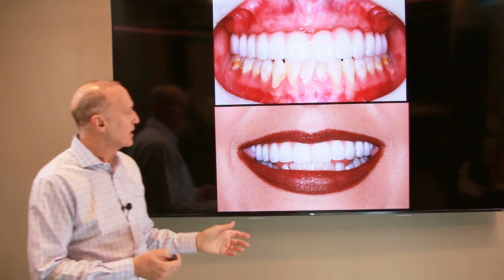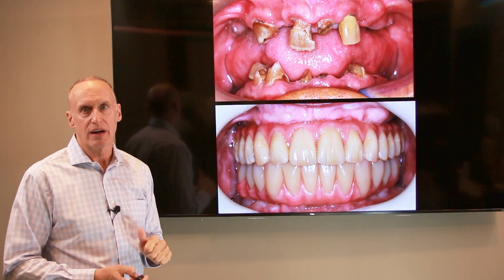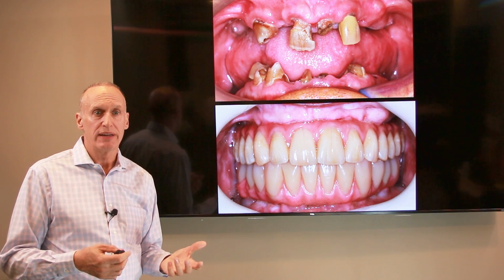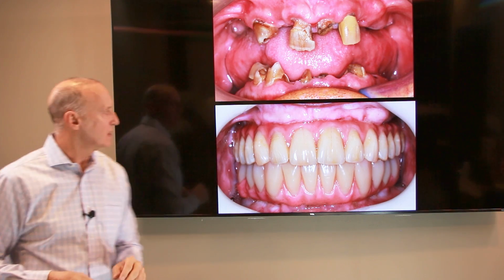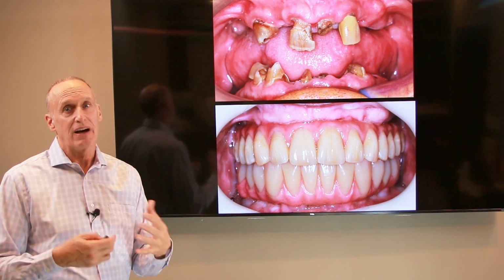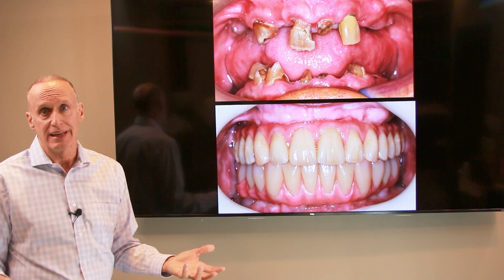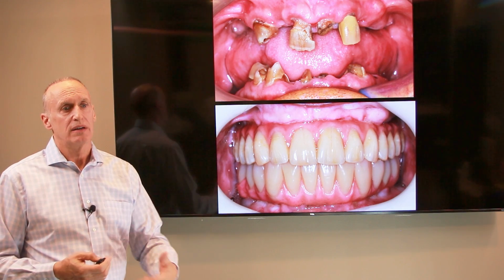And then any of the other treatments are a progression based on what they were missing when they got here. I don't remove bone in the upper arch. Occasionally in the lower arch we have to, because the lower arch bony anatomy comes to a peak that sometimes is too thin for an implant. So sometimes on the lower we do have to remove a little bit of bone, but it's not going to be alveolectomy, it's going to be alveoplasty. All I'm looking for is to get down to a platform that's 5 millimeters in width so I can put in a 4 millimeter implant in there. It's just math. Again, our goal is no pink.